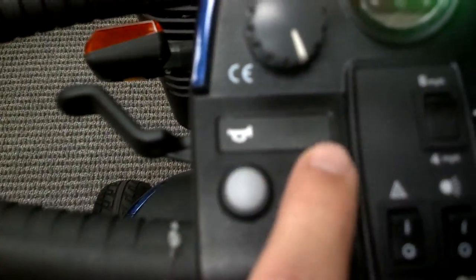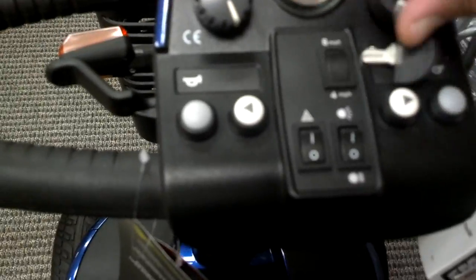It does have blinkers, both front and back. It has a horn. That's the blinker there for right or left. And then here's another horn here. This is the key switch off and on. And then this, of course, is the battery indicator — it tells you the battery life.